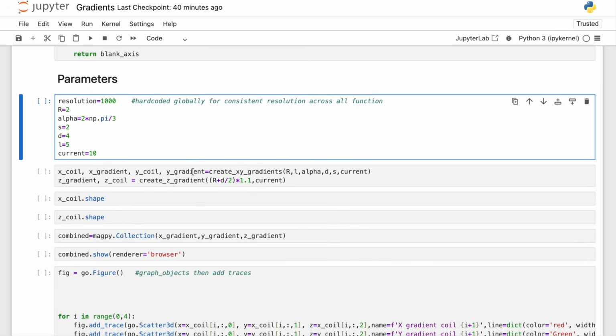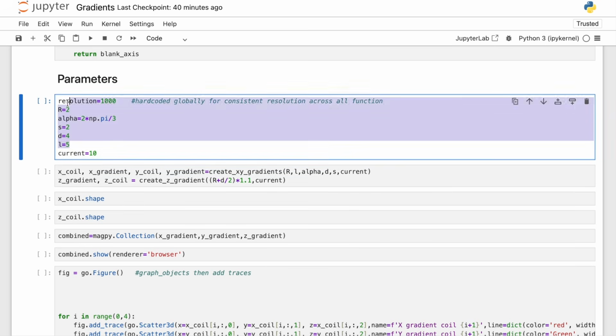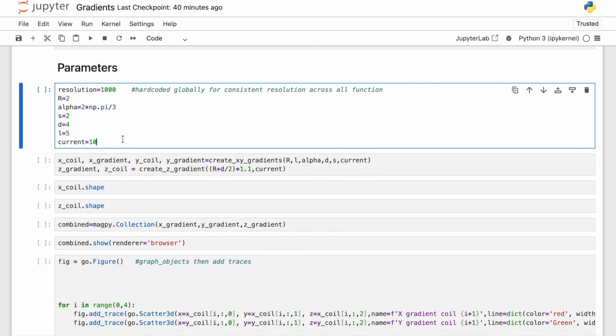So here I use my create xy gradients function to get my x coil, x gradient, y coil, and y gradient, and I input my R, L, alpha, D, S, and current, which I just defined here. So let's run them.